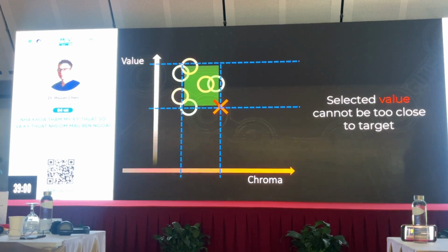And this is the biggest problem that a lot of people have. When we do workshops around the world, people ask me, why does my veneer not look right? It's because you are tricked. You think your A1 shade tab should match the A1 block, but it shouldn't. Okay? So that means we actually don't want our selection to be too close to our shade tab.